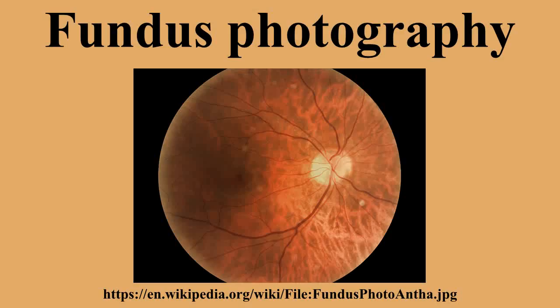Besides the prevalent ocular diseases, fundus photography can also be used to monitor individuals on antimalarial therapy by noting the changes in the fundus during standard screening. Fundus photography is also used in emergency cases, including patients with constant headaches, diastolic pressure greater than or equal to 120 mm of mercury, and patients with sudden visual loss.